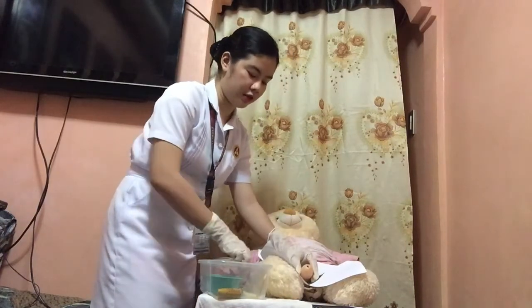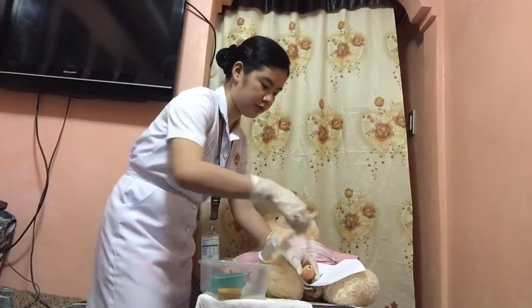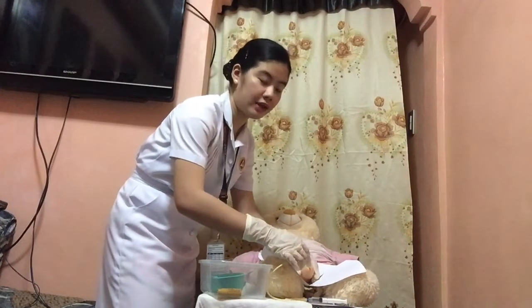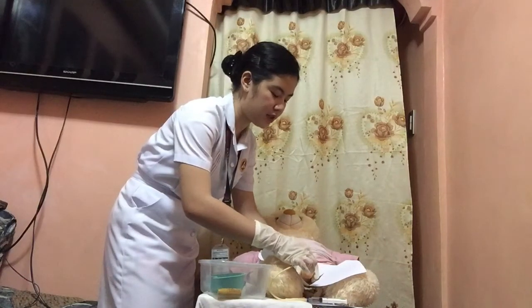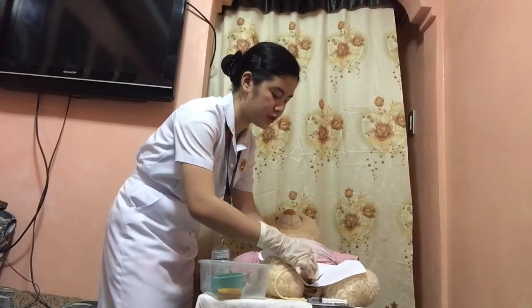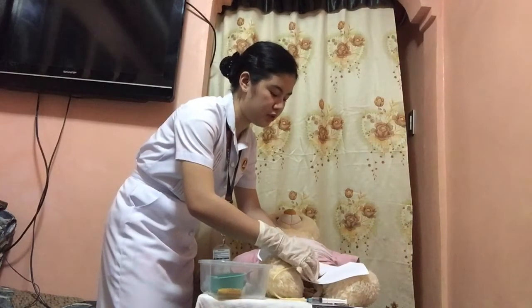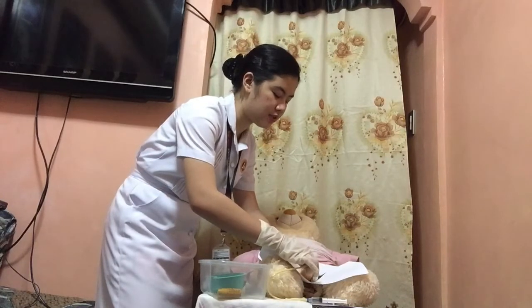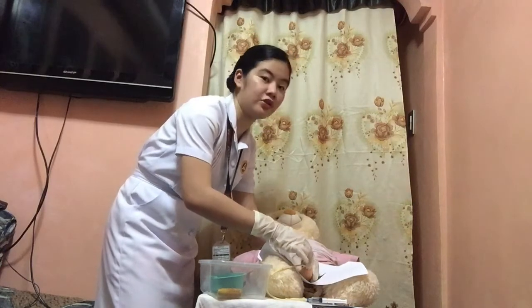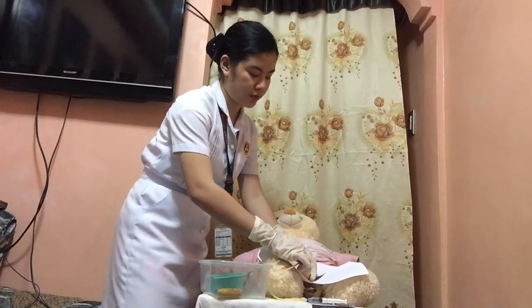After instilling the lubricant, insert the tip of the catheter. Advance the intermittent catheter about 15 to 20 cm or 6 to 8 inches, or until urine flows. Do not use force to introduce the catheter. If the catheter resists entering, ask the patient to breathe deeply and slightly rotate the catheter.